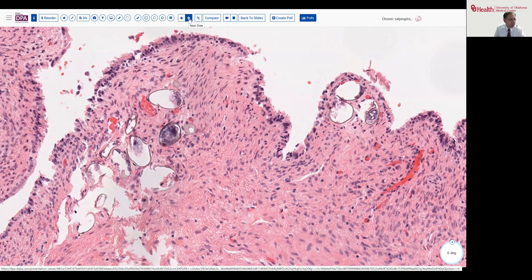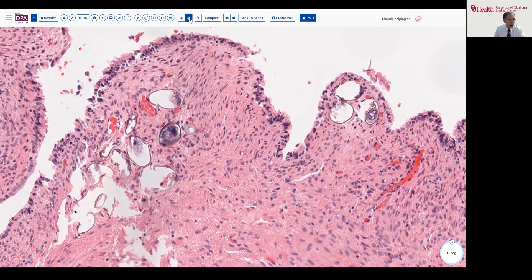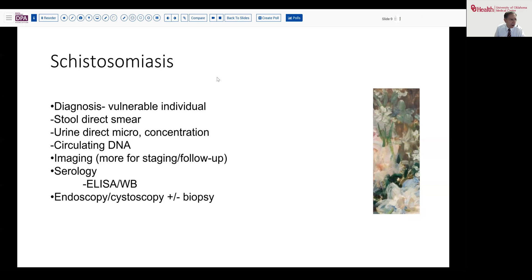This is about the size that we would expect from schistosomal eggs. That makes it likely that schistosomiasis may be responsible for this woman's hydrosalpinx and hence infertility. Making the diagnosis of schistosomiasis should raise the question of where this patient got exposed and how we are going to confirm the diagnosis.